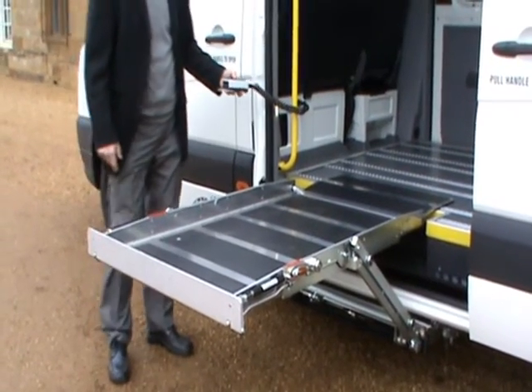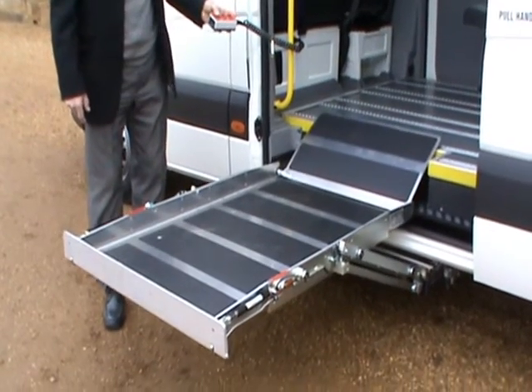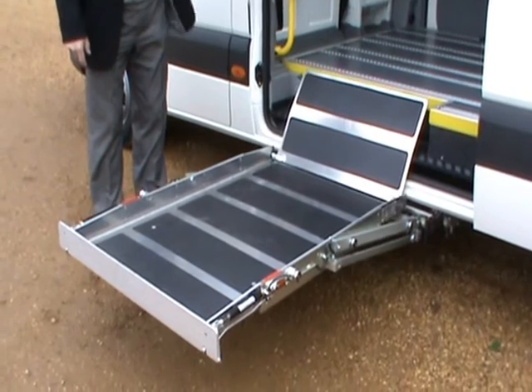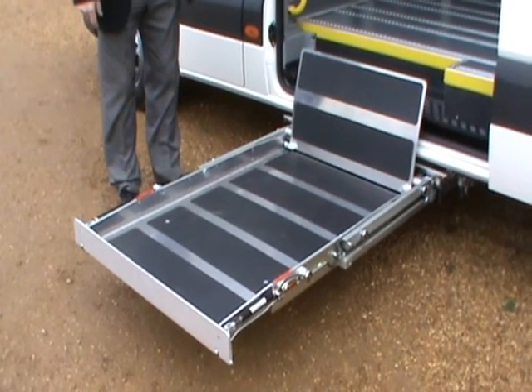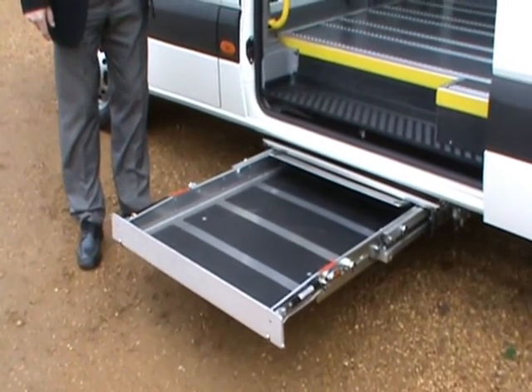To store the lift, it's a simple operation. One button sets it into the correct position for stowing. The lift is back into its home base.